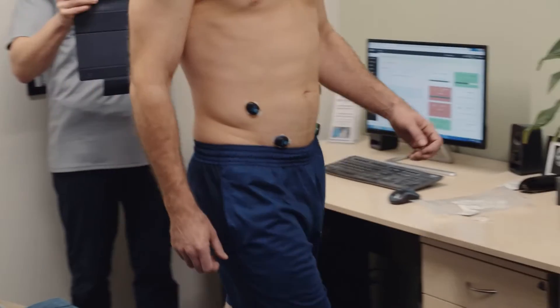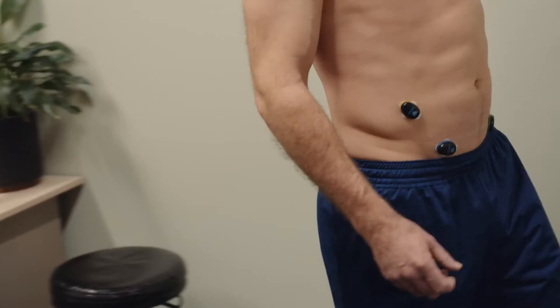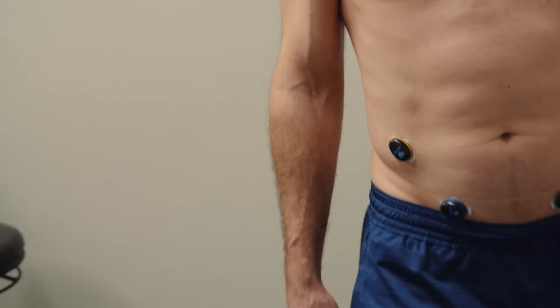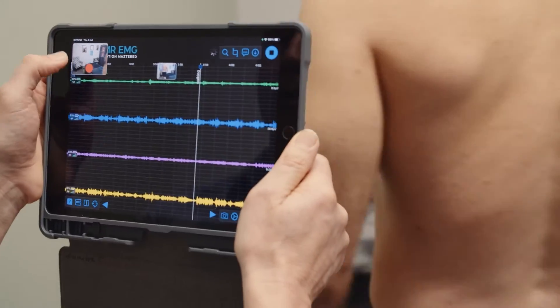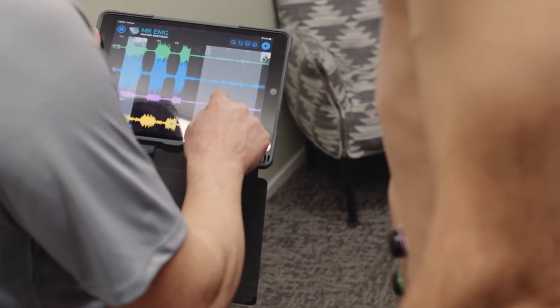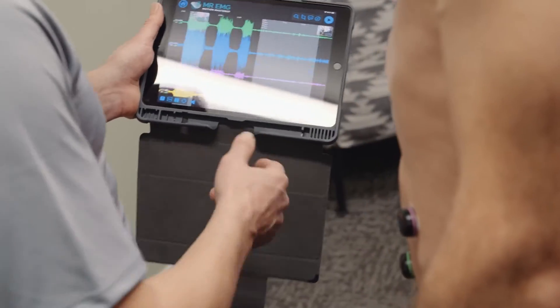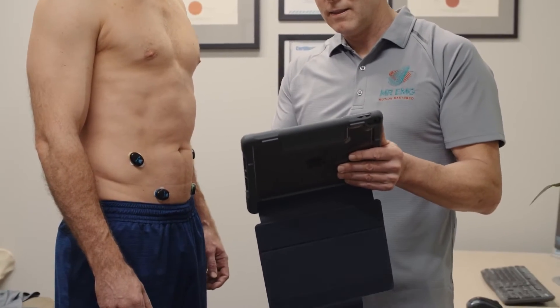Now record the transverse and oblique muscle activity of your subject's natural walking gait. Compare this muscle activity during walking gait to maximal voluntary contractions to assess if any hyperactivity or inactivity is present in the abdominal muscles.